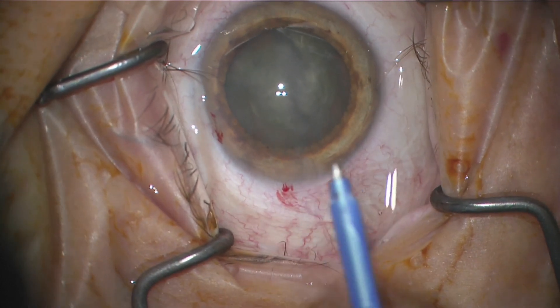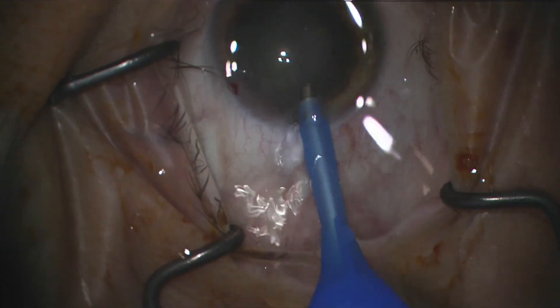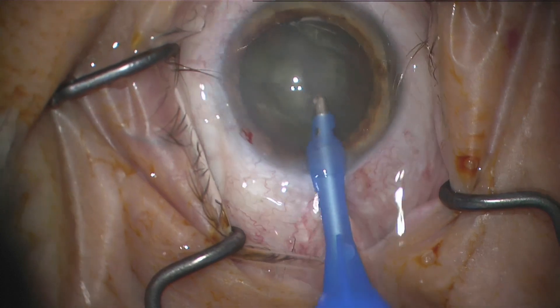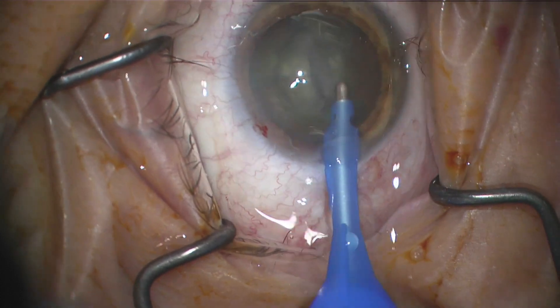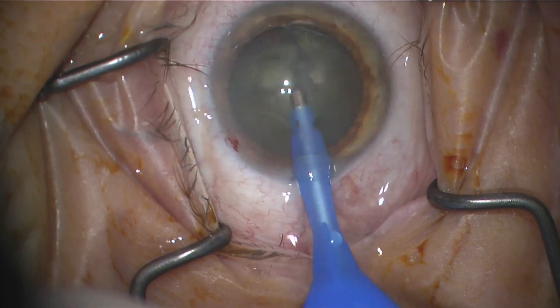I slowed down here so this is all real time in terms of using this device, and yes I'm going very slowly because anytime you're using a new device it's good to go slowly so that you basically don't cause any problems.